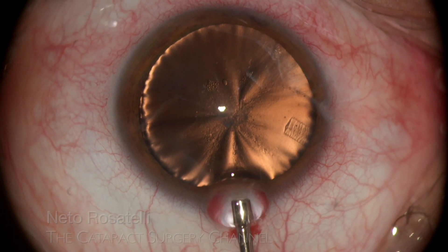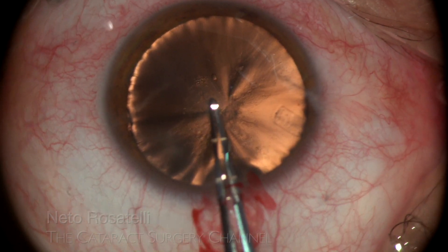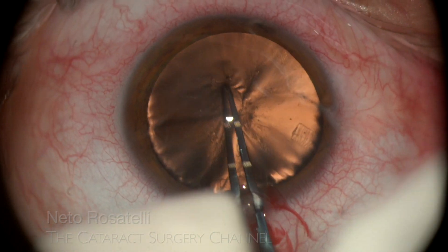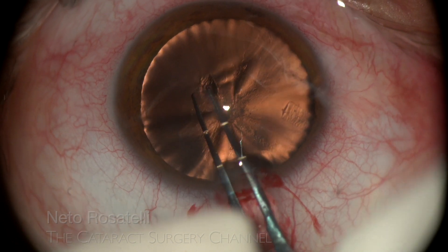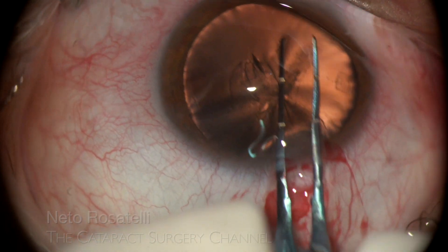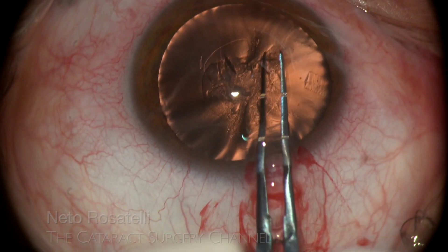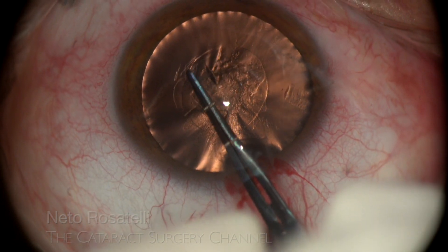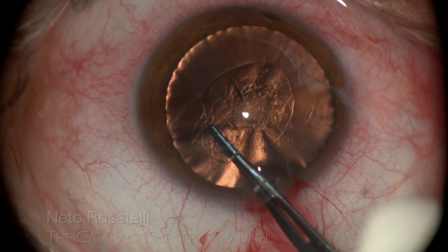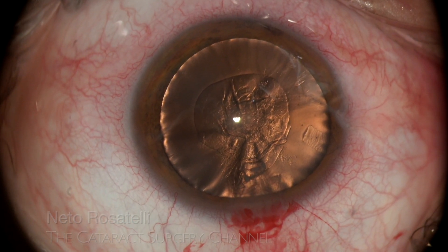0.5 lidocaine is injected, followed by dispersive OVD to fill the anterior chamber. The capsulorrhexis is made with an engraved Inamura forceps, with care not to compromise the zonules. The anterior capsule has a distinct rigid feeling due to fibrotic changes from the trauma, making it difficult to obtain a perfect round shape. This eye has a large anterior segment and despite looking small, the rexis is of adequate size. This is very important because if sulcus implantation is needed, IOL optic capture with the rexis margin ensures IOL centration.